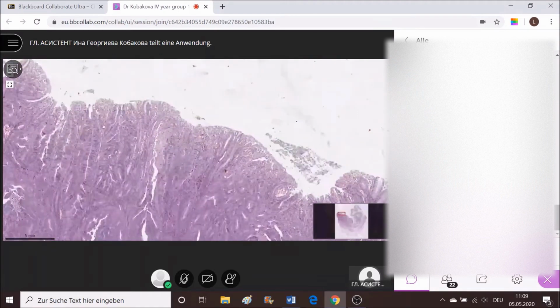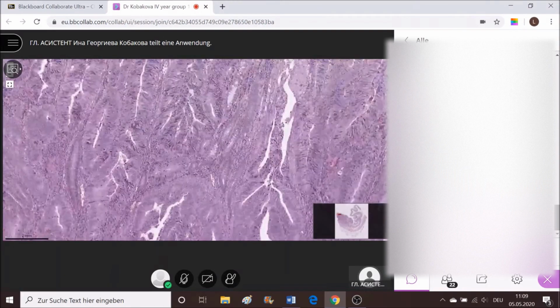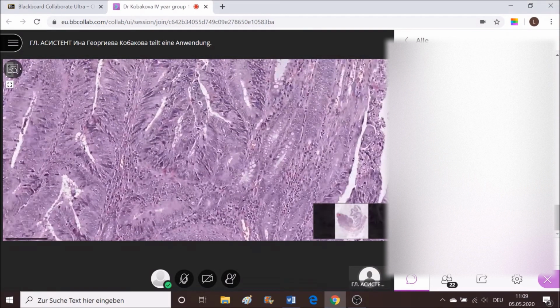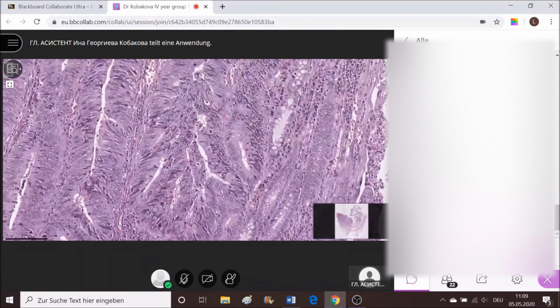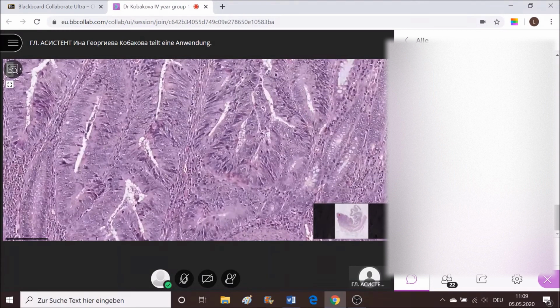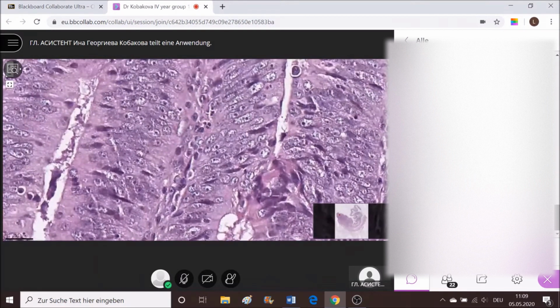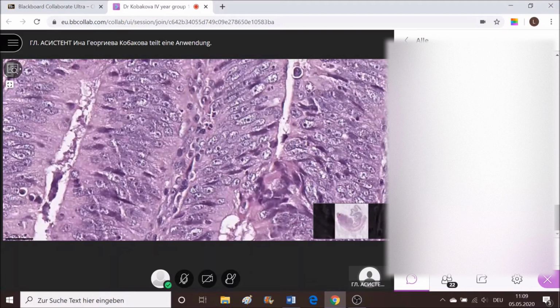They are completely changed, on multiple layers of cells. Do not think of these as elongated glands; the cut of the slide is just like this. The most important thing is that they are on multiple layers with very well marked cellular atypia and prominent eosinophilic nucleoli in each nucleus here and there.